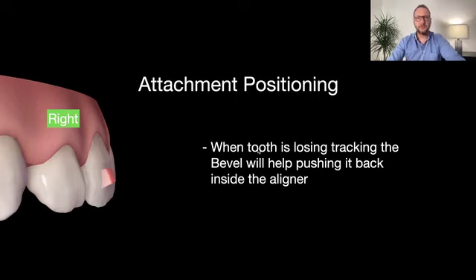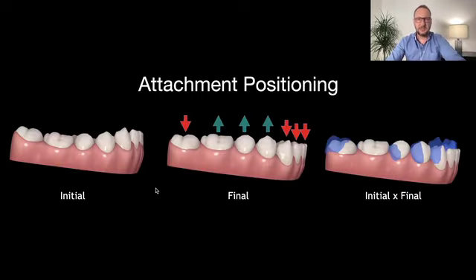So when the tooth is losing tracking, when we place like this, for example, imagine the other image where the plastic was down and the tooth was up. If the plastic is going down, this ramp, this surface, is going to make the plastic leap up again. Okay, this is where we are stimulating, so it's going to facilitate this.